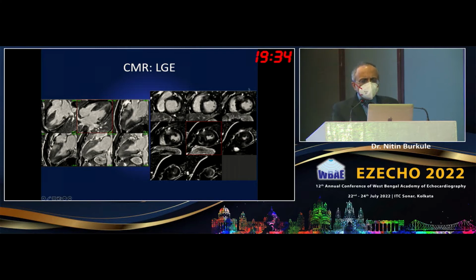So these are like lacy patterns in the septum, much more in the hypertrophied area, very common at the insertion sites of the septum, on either side, and they will be there in the hypertrophied areas. Not only that, you can have certain crypts in the myocardium and certain lengthening of the leaflets. So there are so many features, and especially once you start seeing more and more of these patterns in the septum, you know that this is definitely a phenotype of a true sarcomeric hypertrophic cardiomyopathy. Then you can quantify it.